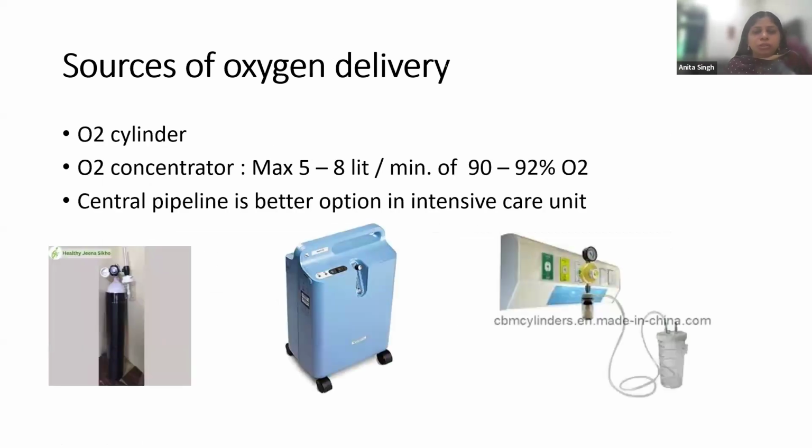So coming to the sources of oxygen delivery, we all work in a hospital setup and we all know where it comes from. Whenever you are doing a transport or transition kind of thing, there is an oxygen cylinder. We all know about the oxygen concentrator by virtue of COVID.